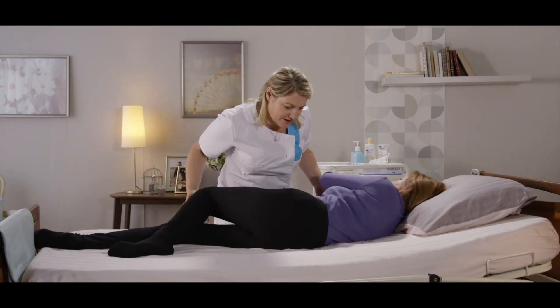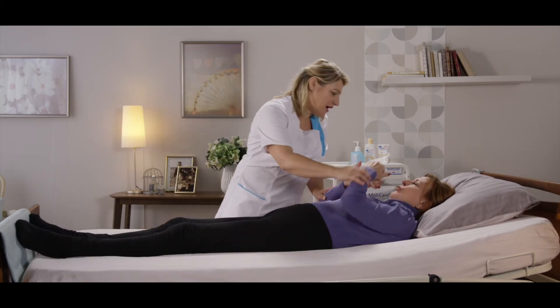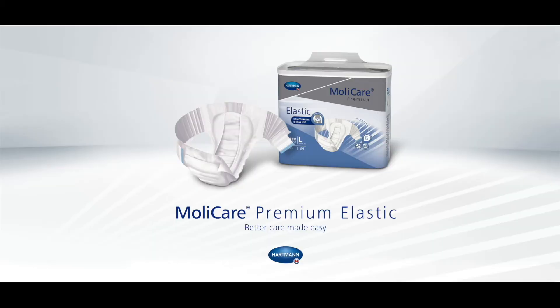Please perform proper PeriCare even if the skin is dry. Due to the high absorbency of MollyCare briefs, the skin is only wet immediately after a void. In order to remove residual urine salts, PeriCare needs to be performed with each product change.